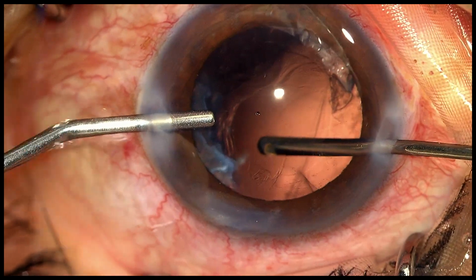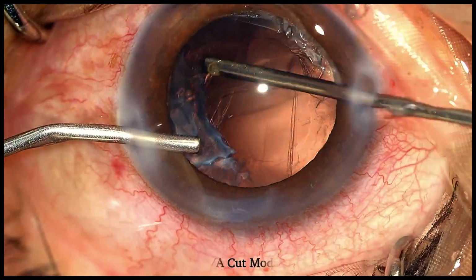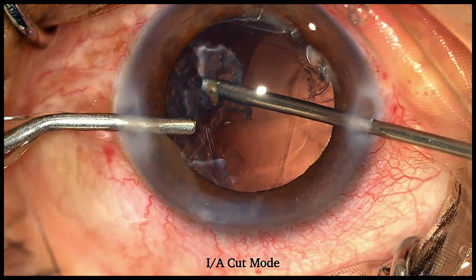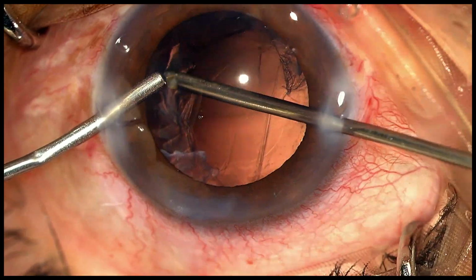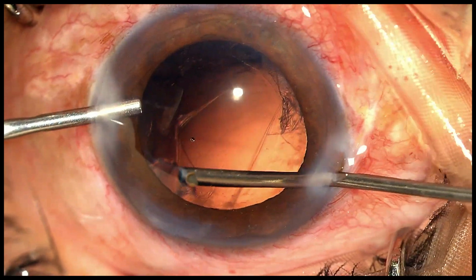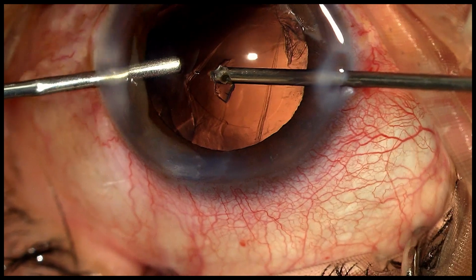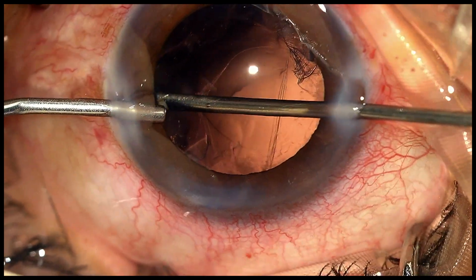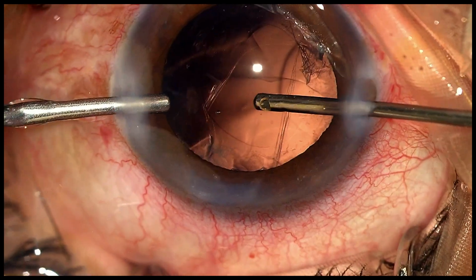Having cleared all the disturbed vitreous, it's now time to address the residual epinucleus and cortex. For that, we use the IA cut mode. Here, we mainly rely on the aspiration of the vitrector to hold, draw out and then aspirate this cortex. So with the IA cut mode, it's the irrigation, the aspiration and finally the cutter. So whilst aspirating the cortex and the epinucleus, should you find a strand of vitreous, from the aspiration you can further depress the foot pedal, go to the vitrectomy and cut that strand of vitreous, after which you can go back to the aspiration to remove the cortex.